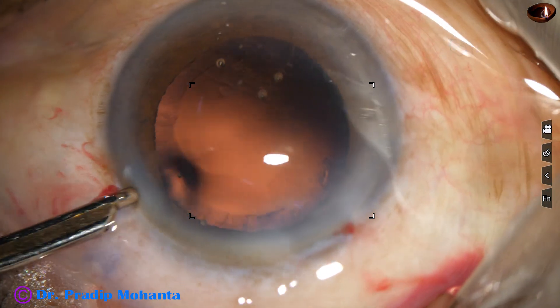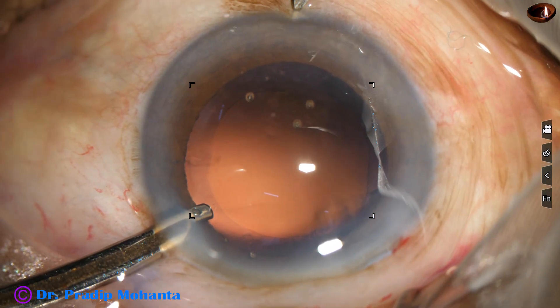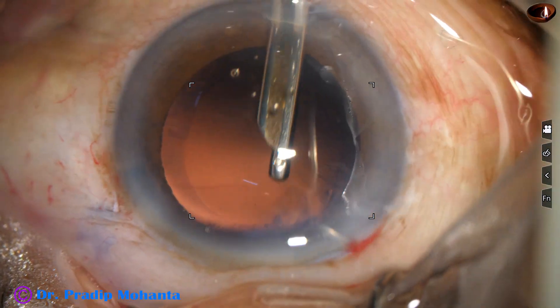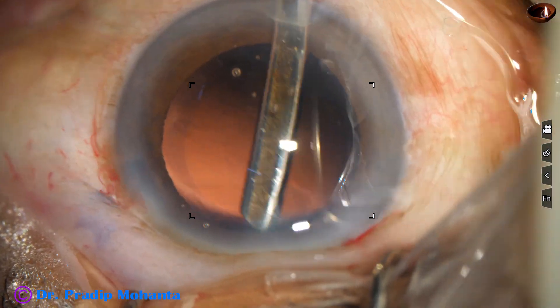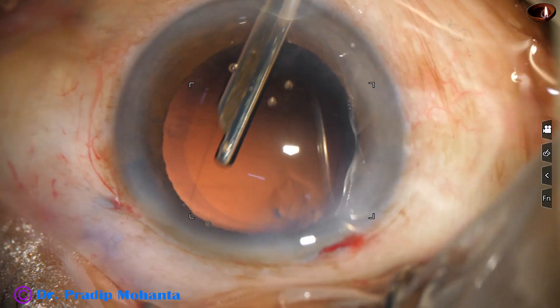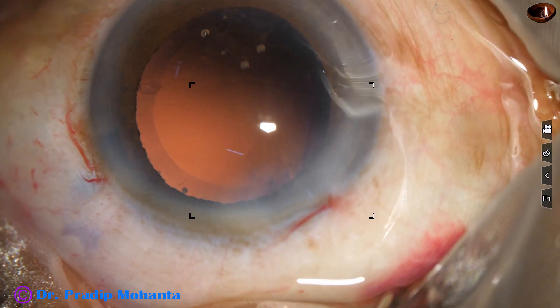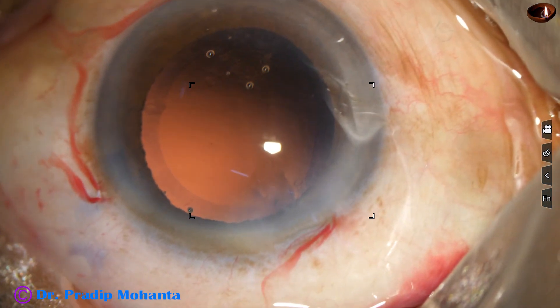I find that the side port is very small, so I am going to make another port at 6 o'clock. Introduce the Simcoe through this and remove the cortex from 11 o'clock to 1 o'clock. This is a very nice way to remove the sub-incisional cortex — make a side port at 6 or 7 o'clock through the sclera just behind the limbus so that this wound doesn't require any hydration.